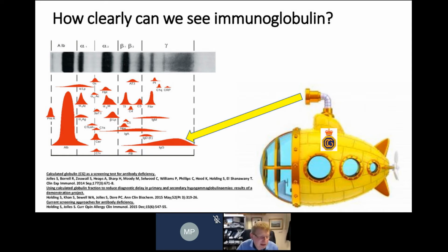And on the left-hand side, and I'm sorry that I can see my pointer, but I don't think you can, is albumin. And that is the biggest protein, the biggest in terms of amount. If you subtract that away from all the others, you will then get a snapshot onto IgG, accepting that there are these other proteins there as well. So it is a snapshot rather than a perfect measurement.